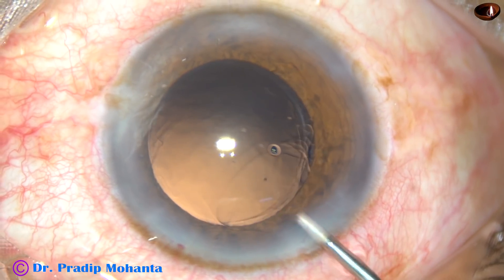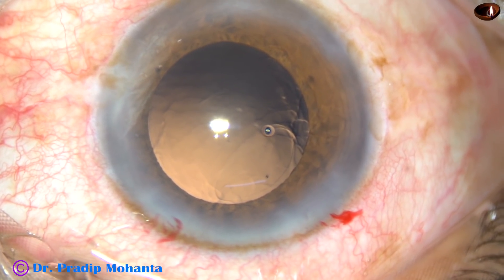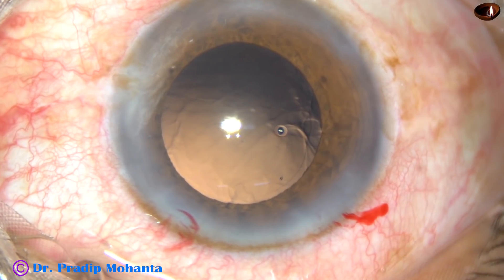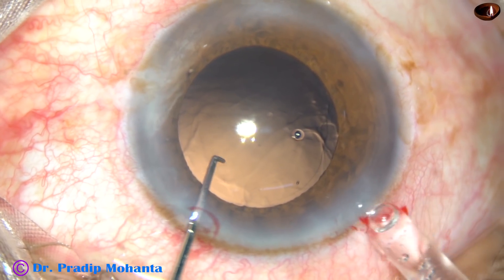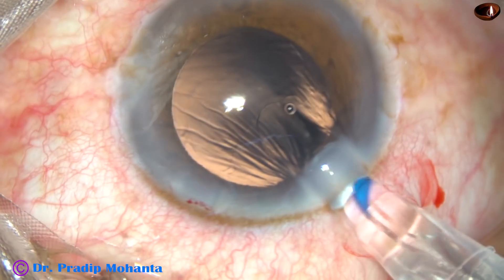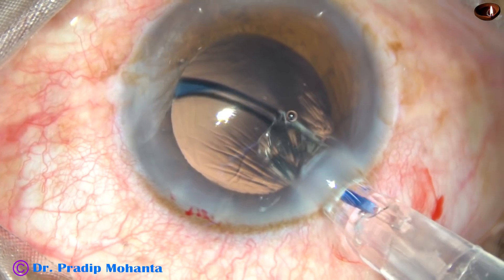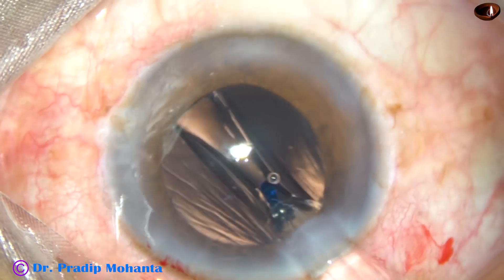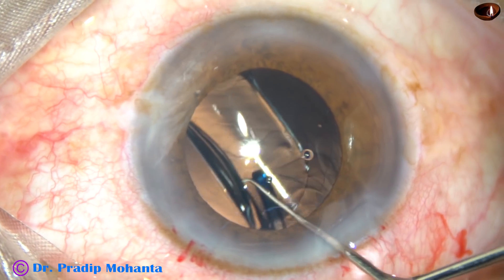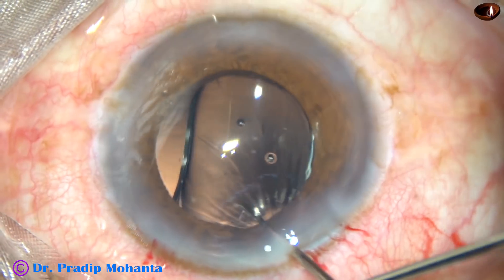Now in this case we have a Hoya intraocular lens. Since this is a device where we need both hands, the left hand holds the cartridge and the injector, and the right hand screws out the lens into the capsular bag. Here goes the leading haptic — it is going straight into the capsular bag — and now the trailing haptic is pushed into the capsular bag. The lens is dialed so that the haptics are 90 degrees away from the main incision.